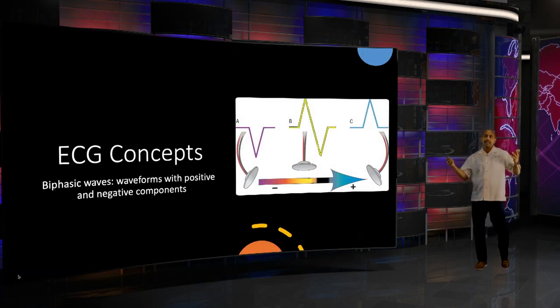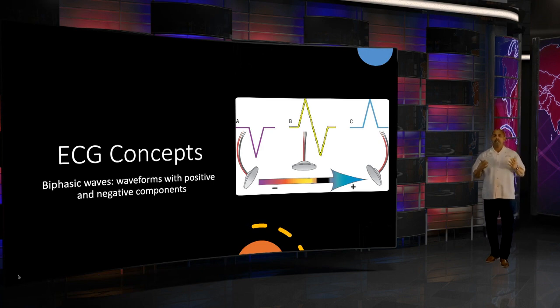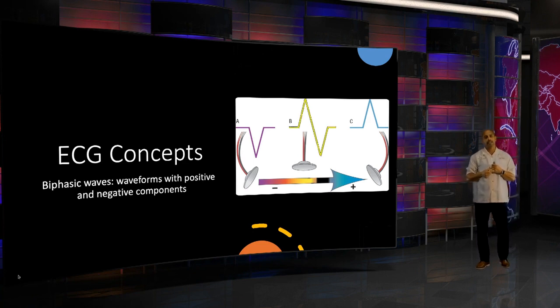And that ECG concept is, we're talking electricity always wants to move towards its positive. How? Directly. Because the more directly I move towards that positive, the stronger the current. That's the 220 I referenced, going to Home Depot and getting a 220 outlet. I could move towards the positive, but not so directly. Now I'm talking about the 110. 110 is enough to produce electricity and give us good current and contractility, but we like the force, we like a stronger contractility.